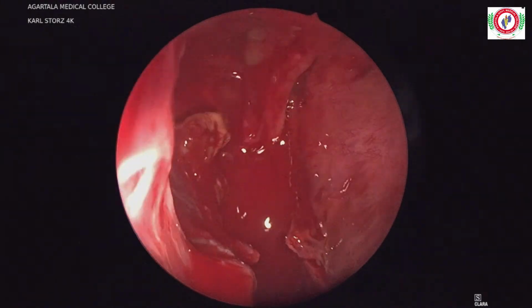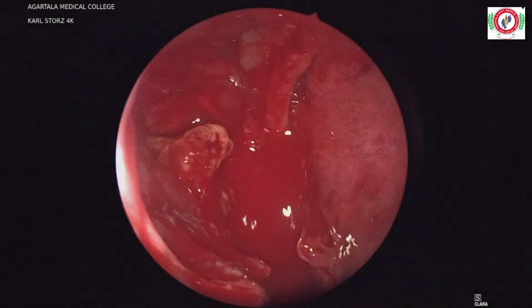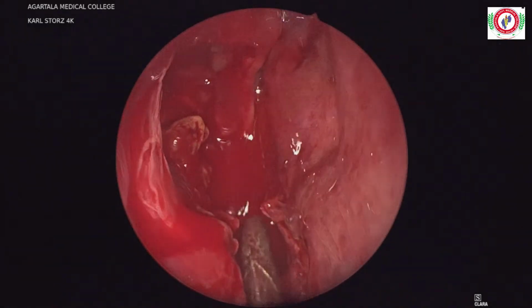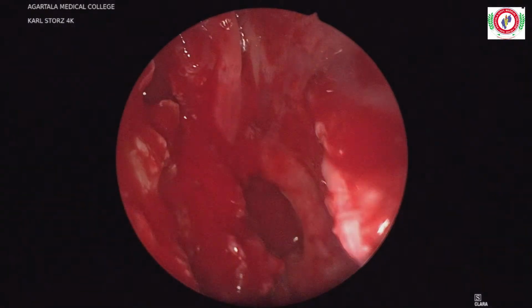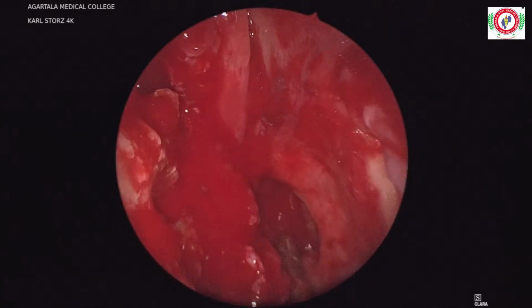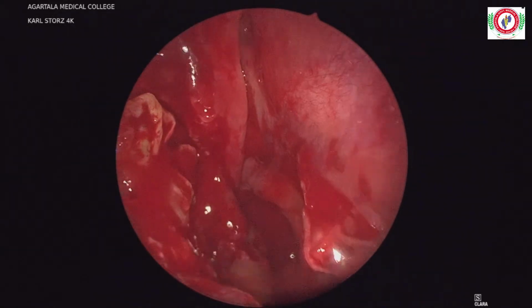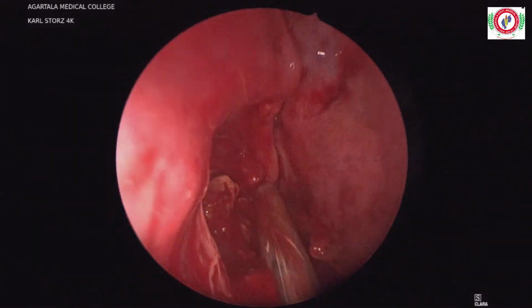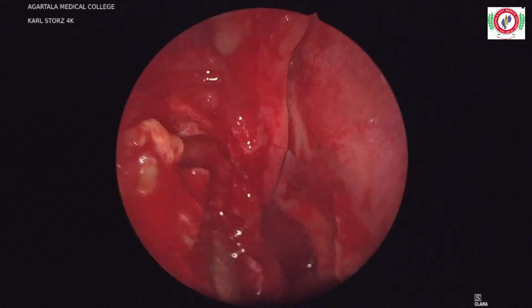So that is the maxilla. Okay. So that is the cut end of the middle turbinate most likely. Can you see this? All right. This is a third revision case. Yes. Okay. And all this thing is maxillary sinus suction. This is a tumor. This was a very vascular tumor that was completely filling the nasal cavity.